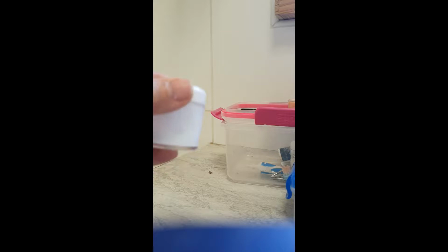So this little container is medical grade glue. It is in a tiny little separate container. I've got a bigger container in the cupboard. A bottle of glue is about 350 rand for one bottle. And because you open, close, it can go hard. And then you've paid a lot of money for glue that you can't use. So I was advised to decant. There's another one also in my box. And then just work on the decant.